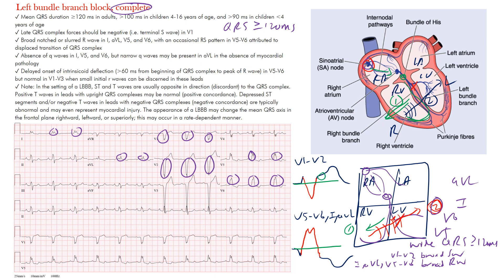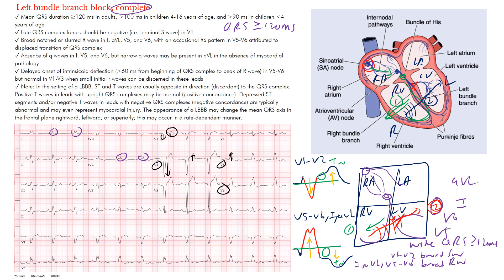Discordance means the main QRS vector goes in the opposite direction of the ST-T wave. Where the complex is mostly going down, you see ST elevation and an upright T wave; where it's going up, you see ST depression and an inverted T wave. This discordance is normal in the setting of a bundle branch block — the same applies to right bundle branch block. You can see this clearly in V2, and in V5 and V6 where the complex is positive followed by a negative T wave.